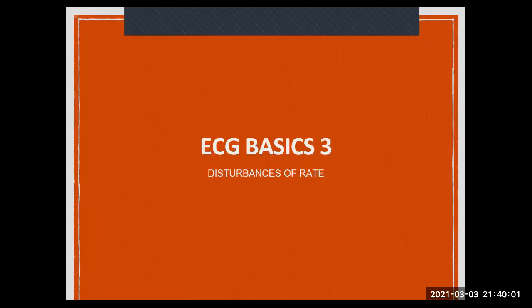Hi, everybody. So this is the third one that we're going to talk about. We're going to talk about rate disturbances, and rate and rhythm go hand in hand. So we're going to cover both of those again. Sorry, what I mean is we'll cover rhythm again. Even if you didn't catch up to everything before, you should hopefully catch up to everything now. So let's get on to it.